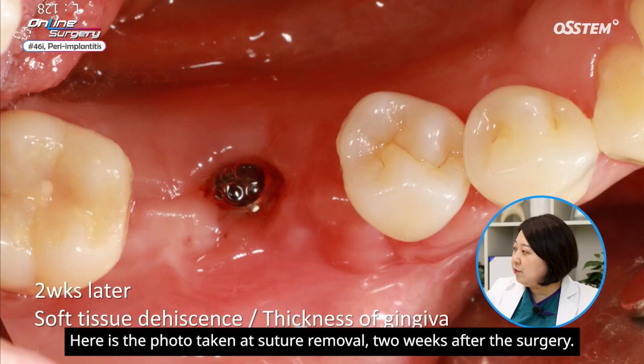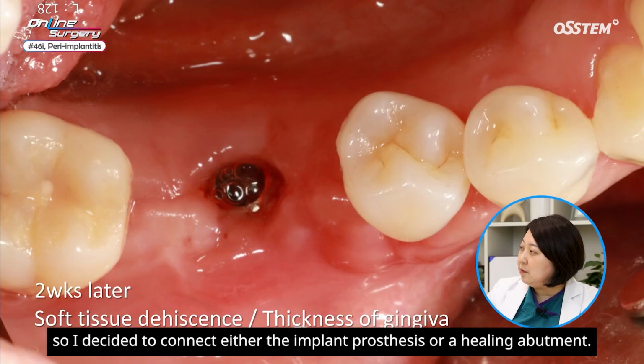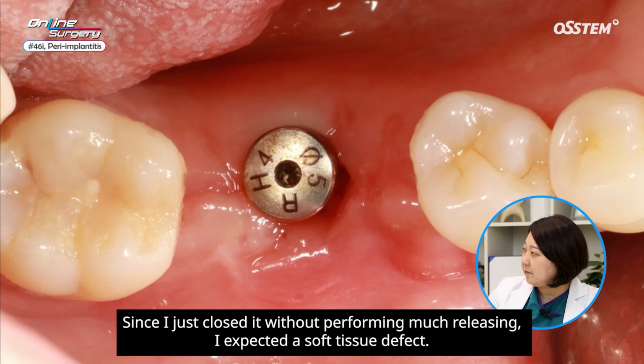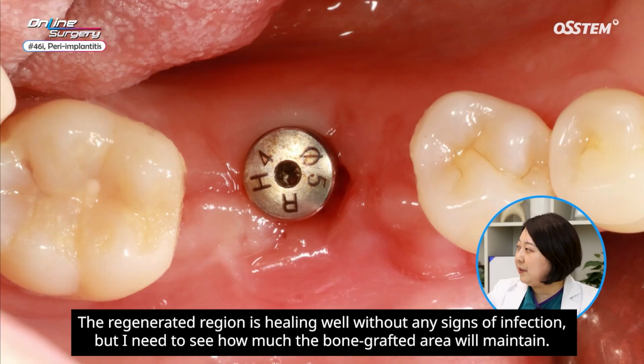Here is the photo taken at suture removal, 2 weeks after the surgery. There was some dehiscence. So I decided to connect either the implant prosthesis or a healing abutment. Since I just closed it without performing much releasing, I expected a soft tissue defect. I first connected the healing abutment, and later I will connect the prosthesis. The regenerated region is healing well without any signs of infection, but I need to see how much the bone grafted area will maintain.